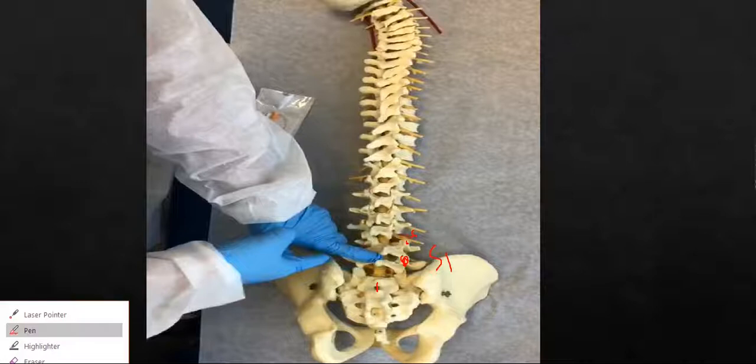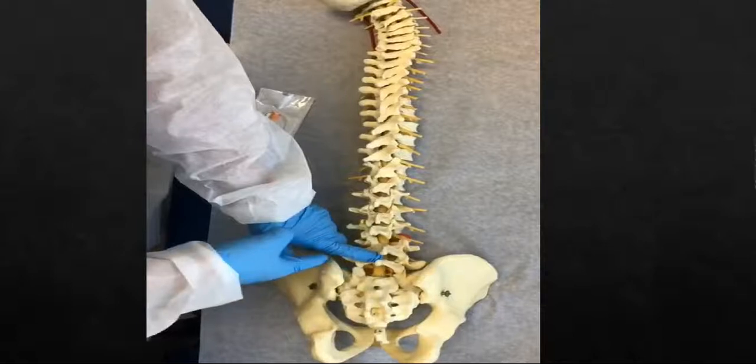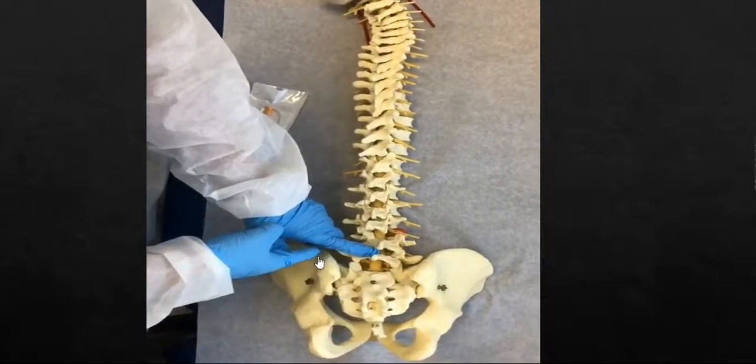In my office, for example, we have a policy that we do a musculoskeletal ultrasound to guide the needle insertion when we do vertebral paraspinal needle examination. First I'm going to go through the blind technique, and then we're going to go through how to use diagnostic ultrasound to ensure appropriate localization of the level.